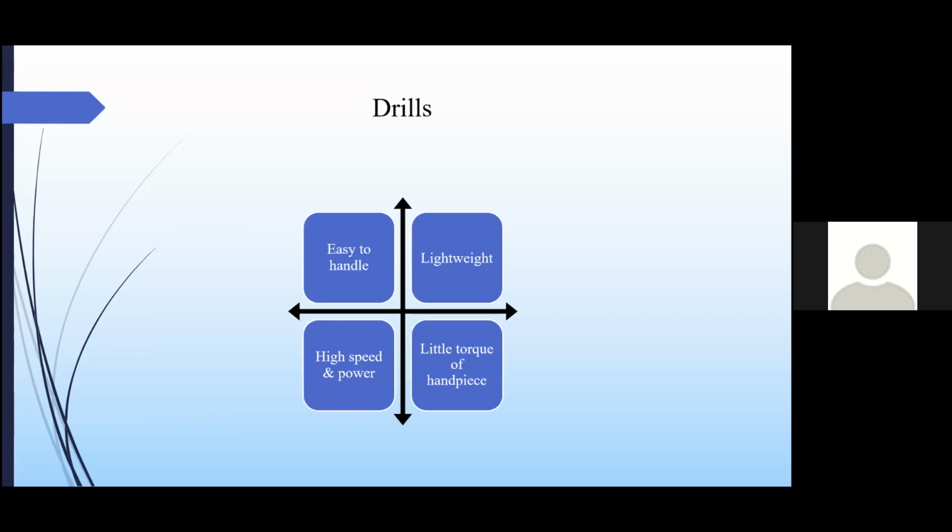First, the drills. Drills are versatile tools. They enable us to drill the bone millimeter by millimeter while keeping the delicate underlying structures intact. An ideal drill should be easy to handle. It should be lightweight, so that the operator does not get tired, depending upon the surgery which is performed. And the handpiece should not give torque while initiating or at the time of cessation of the drilling.